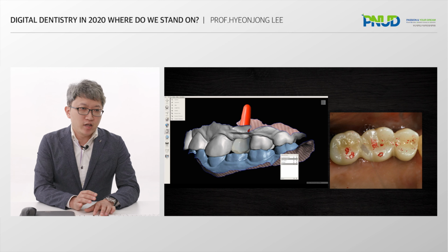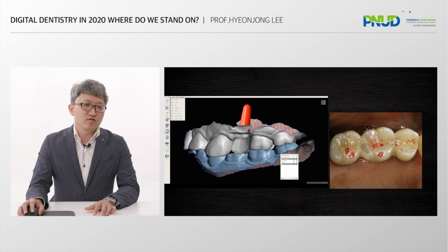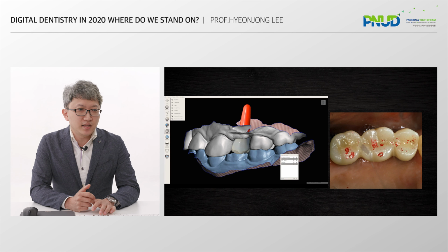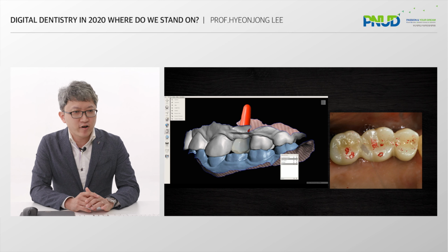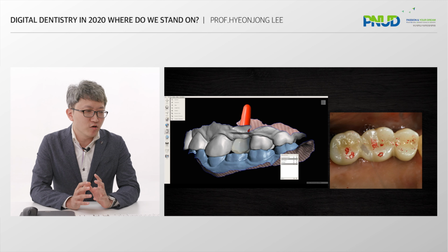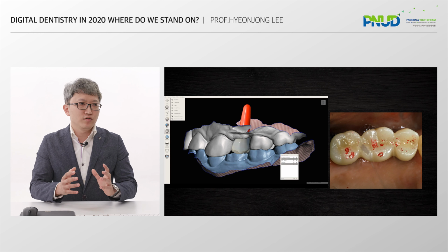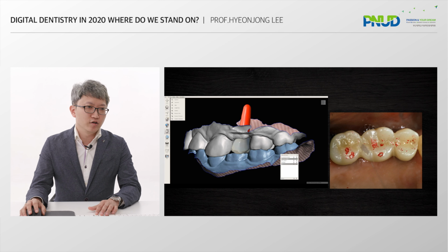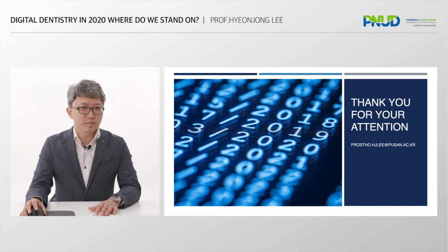And when it is integrated into the dental CAD software, it would be much easier to utilize when designing the crown. So I think this is where we stand and where we are heading in 2020, the era of digital dentistry. The intraoral scanner will be greatly innovated using various sources of light, as I mentioned, like infrared wavelengths, and I hope software will be greatly improved further.